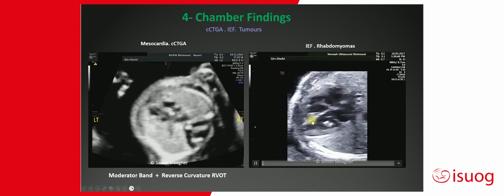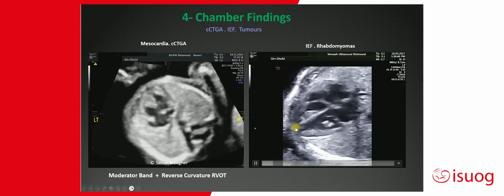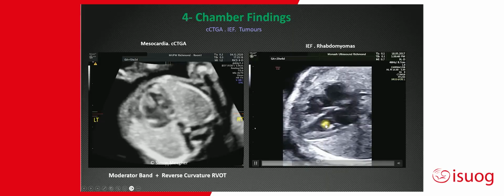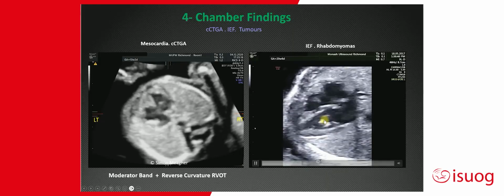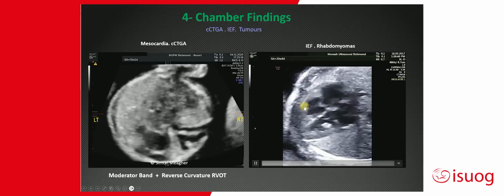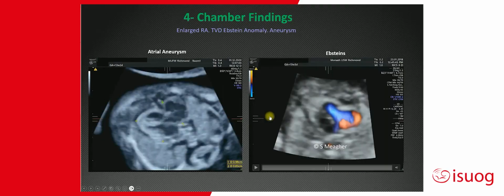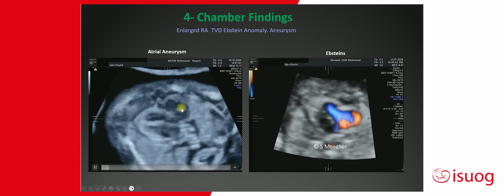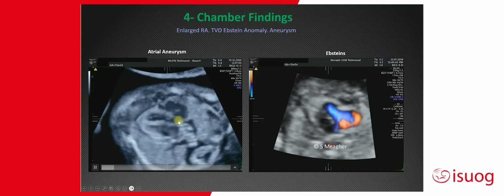And as you come here, you have the four-chamber view of heart, descending aorta, intracardiac echogenic foci, just at this point here. And you always need to consider the possibility whether these could be cardiac rhabdomyoma, and sometimes there's a crossover between the two.